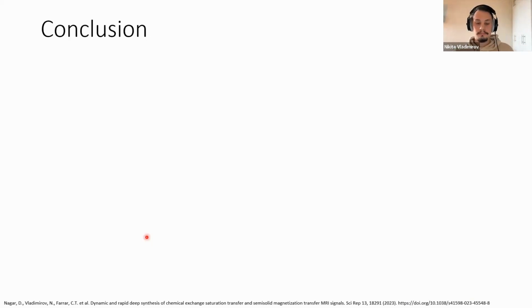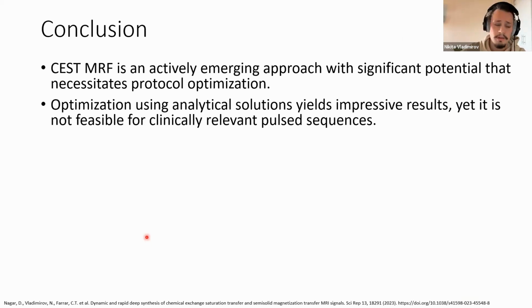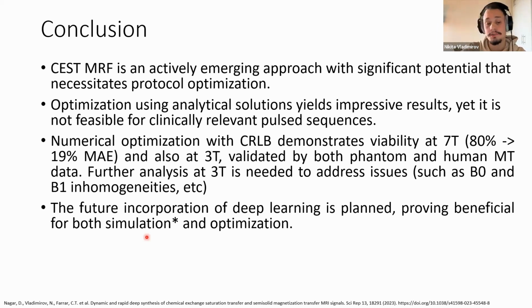So let's move to the conclusions. CEST MRF is a good approach, but we need further analysis and to optimize all protocols. The best way to optimize is to use analytical solutions, but it is not feasible for clinical pulse sequences. Numerical optimization works, but there are some problems which still might be researched.